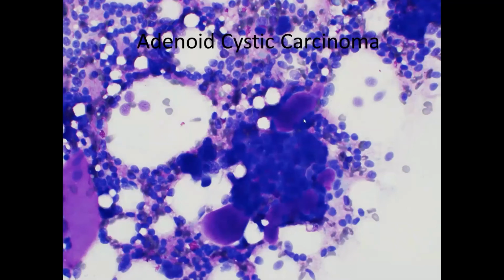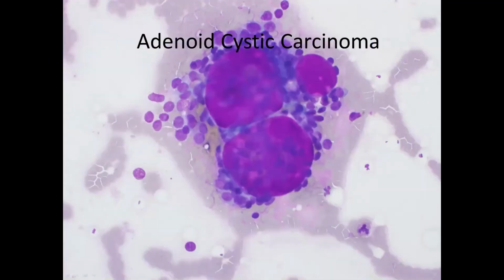As far as the relationship of the cells to the stroma, you can appreciate that in an adenoid cystic, you typically have the cells and the stroma sharply demarcated from each other. You can see a sharp line and distinction between the stroma and the basaloid cells. We don't have the cells percolating through the stroma as we did in a pleomorphic adenoma. And again, the final important thing to pay attention to is the stromal material. Classically, in adenoid cystic, you get these nice homogeneous balls of stromal material. We don't have that fibrillary quality.